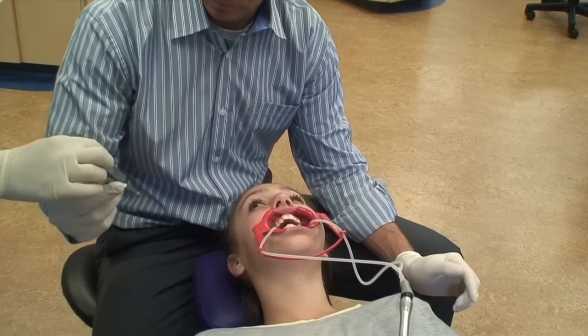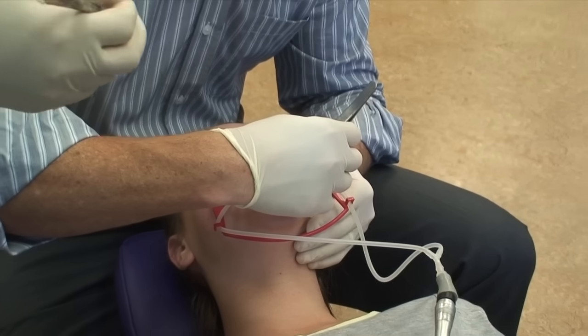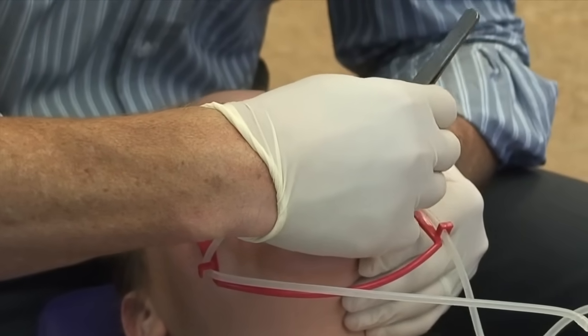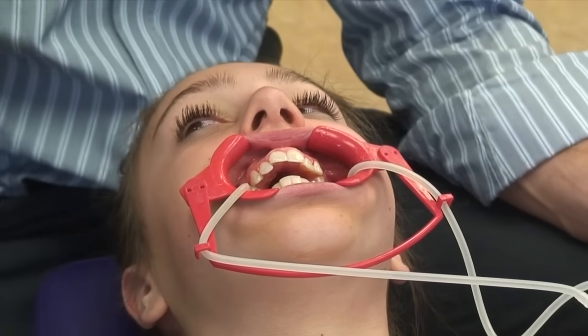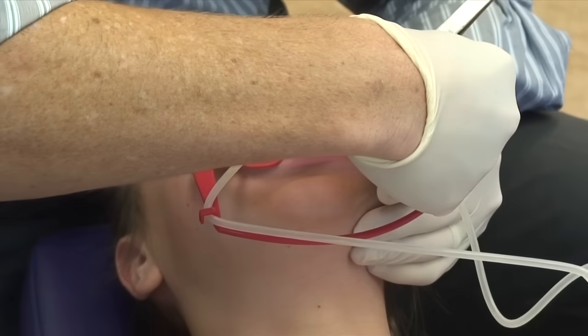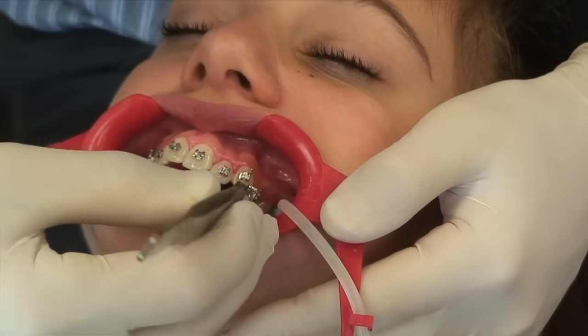And then here you'll see me come in and put on each of the braces one at a time. Now the braces, we call them brackets, each have a little bit of glue on them, and we put them on the tooth just like you'd put a sticker on something. So you put them on just like a sticker, but the glue is not yet set or dried, so it allows us to work with the braces.